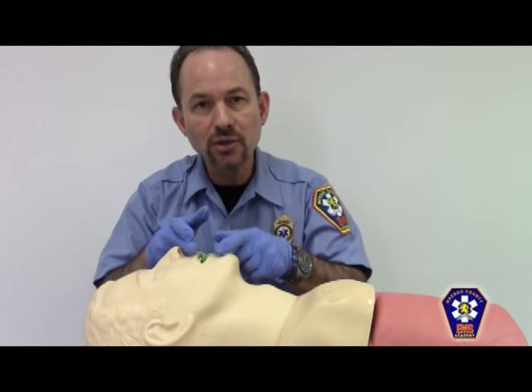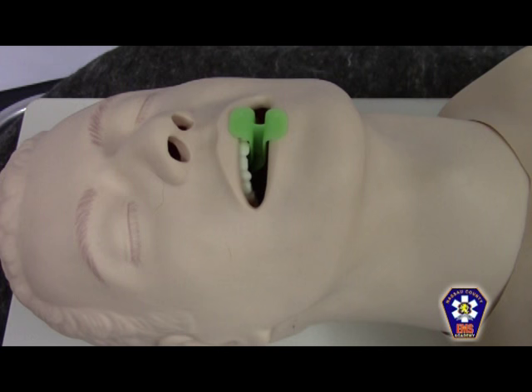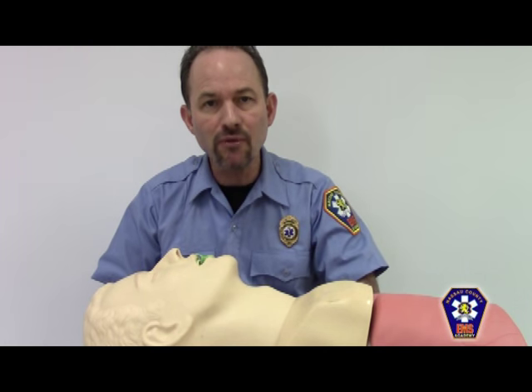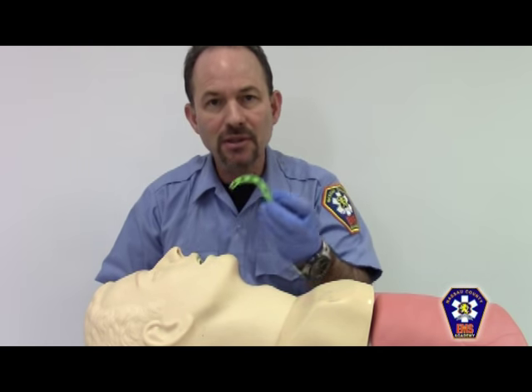The flange of the OPA should lay outside the mouth at all times. If it becomes necessary to remove an oral pharyngeal airway, do so in the natural anatomical direction, like so.